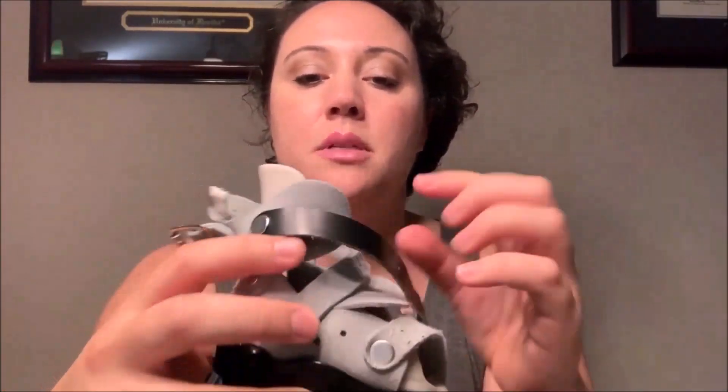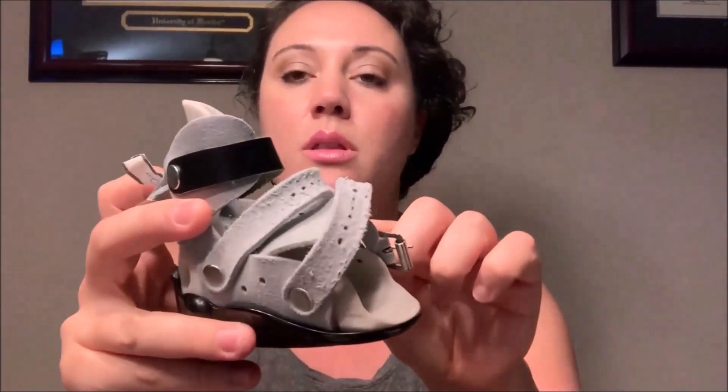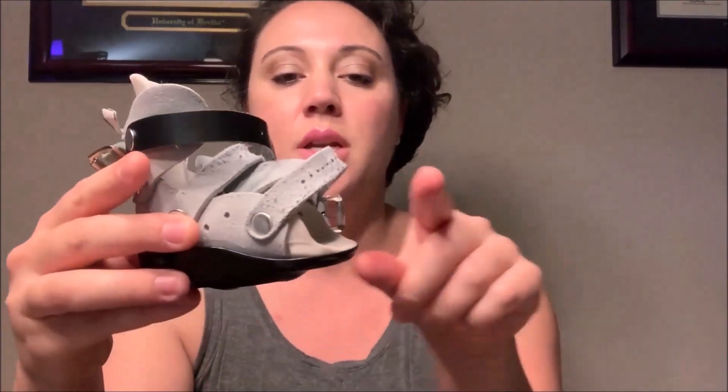The boots themselves look like this — they have three straps: one across the ankle to hold the foot in the boot, and one over the top of the foot. These were his first set of boots. He wore them 23 hours a day with one hour off, for about five months from June to about November. Then he got to wear them only at night and nap time, and now in April he moved to just wearing them at night. His foot has grown — this is his second set now, the exact same setup.